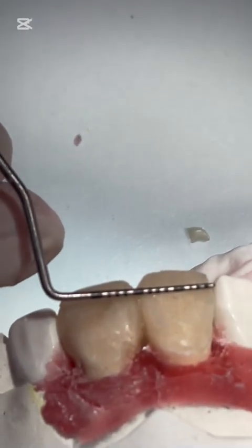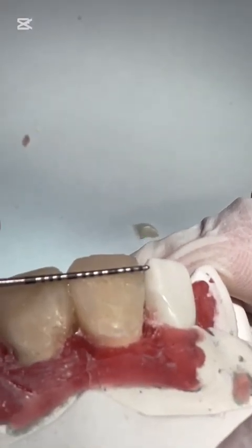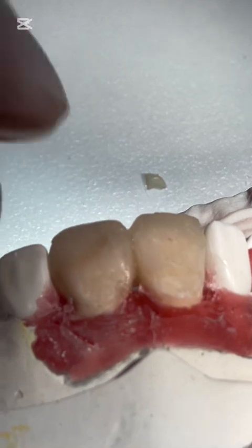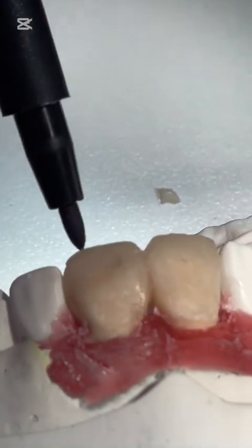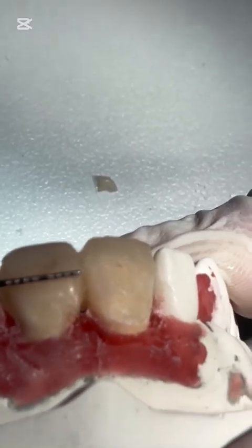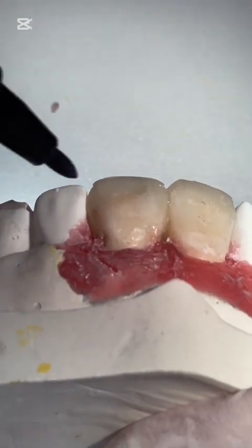Here's the width. About 10, yeah, and a half. Now the length. I have to reduce this a little bit. And here the width is more. I have to do some reduction here.